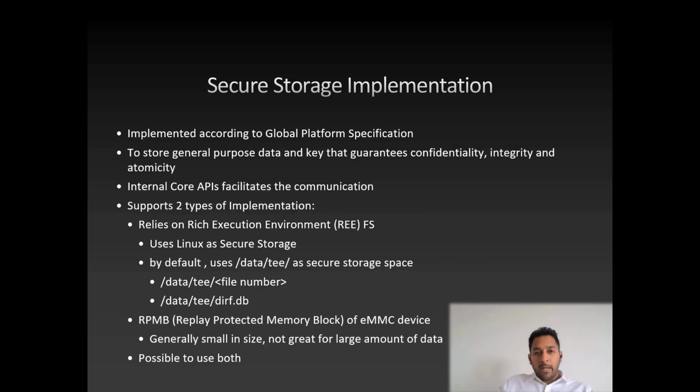All right, let's look at secure storage implementation strategy. If your device has OP-TEE, then secure storage must be implemented according to the GlobalPlatform specification. This secure storage can be used as general purpose storage. You can store your PHI data or any other sensitive data that guarantees confidentiality, integrity, and it typically supports two types of implementation.